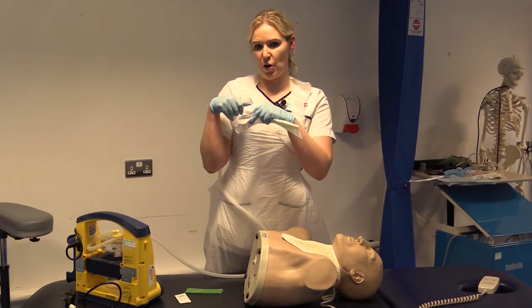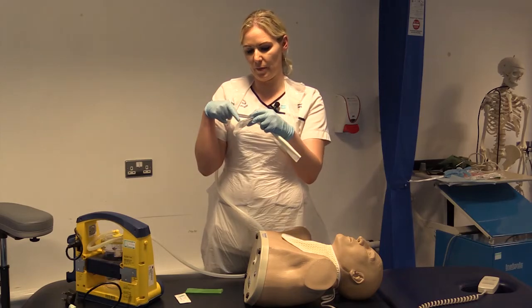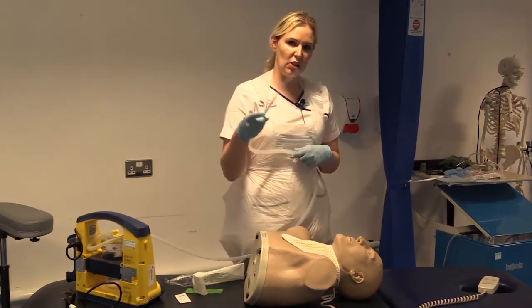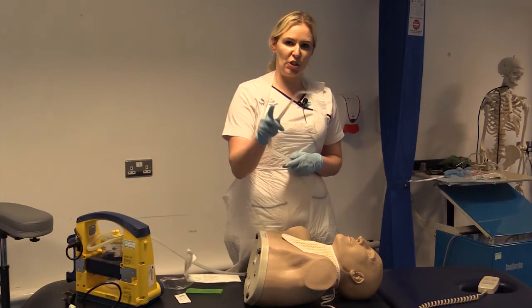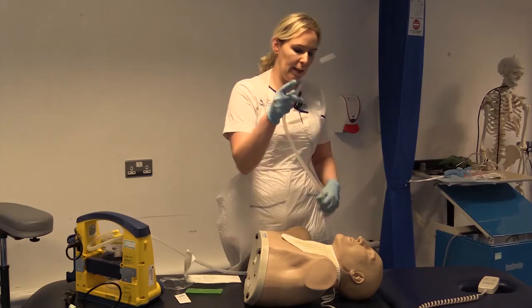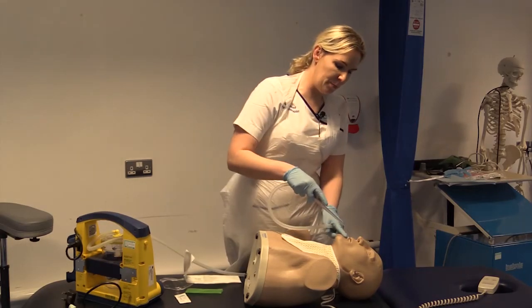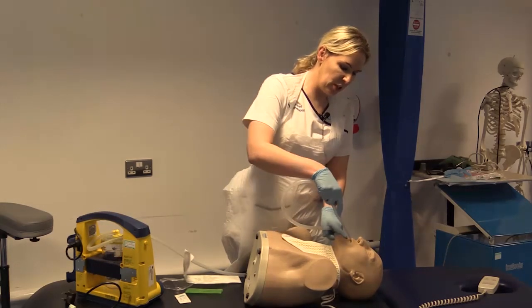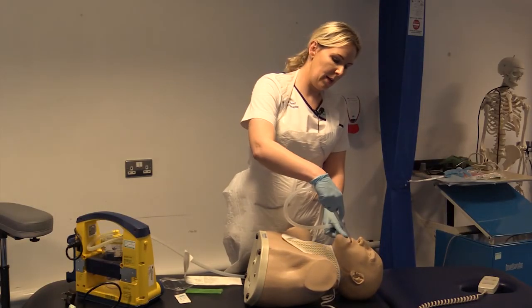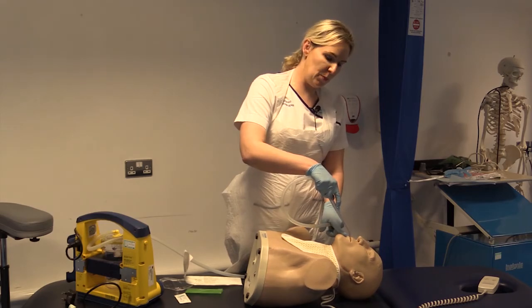Okay, you're going to slowly remove the upper part of your Yankauer catheter from the plastic sleeve. Okay, again, you're going to explain to your patient that suction is going to occur. You're going to keep your suction off until you're into the patient's mouth. Okay, so you're going to gently insert the tip, apply your suction, and you're going to remove all visible secretions in the mouth. And as you withdraw, keep your suction on.